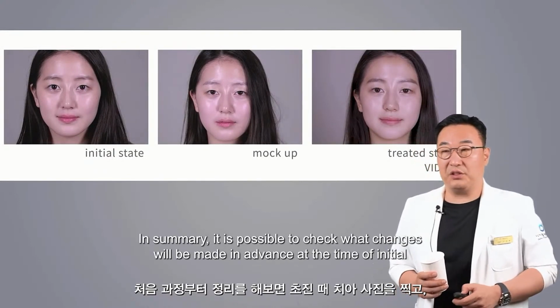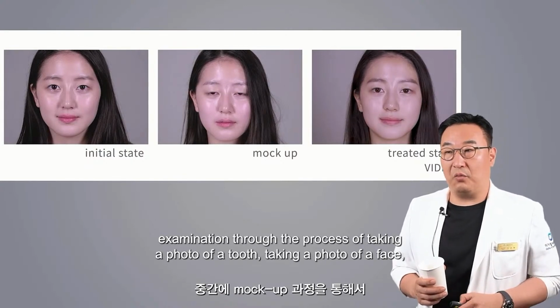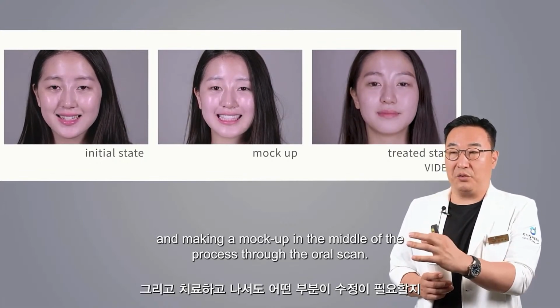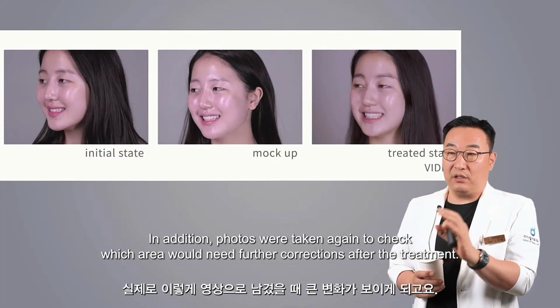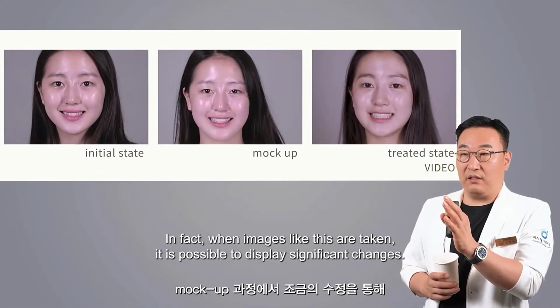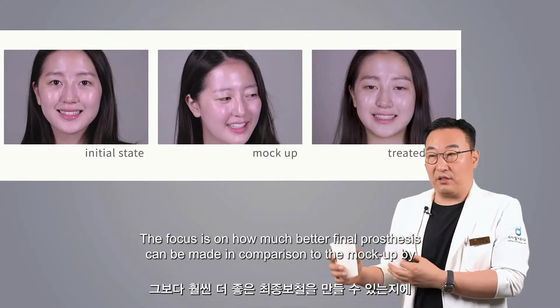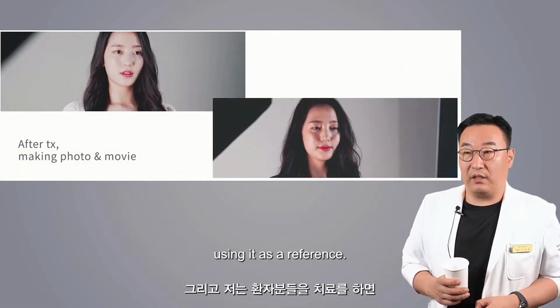In summary, it is possible to check what changes will be made in advance at the time of initial examination through the process of taking a photo of a tooth, taking a photo of a face, and making a mock-up in the middle of the process through the oral scan. In addition, photos were taken again to check which area would need further corrections after the treatment. In fact, when images like this are taken, it is possible to display significant changes. The final prosthesis was made through a slight correction in the mock-up process. The focus is on how much better final prosthesis can be made in comparison to the mock-up by using it as a reference.